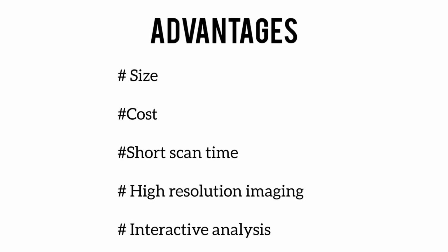And high resolution imaging. Fine details of structures like PDL space, root canal morphology, root fractures, relatively low patient radiation dose, and interactive analysis viewing can be done on a personal computer.